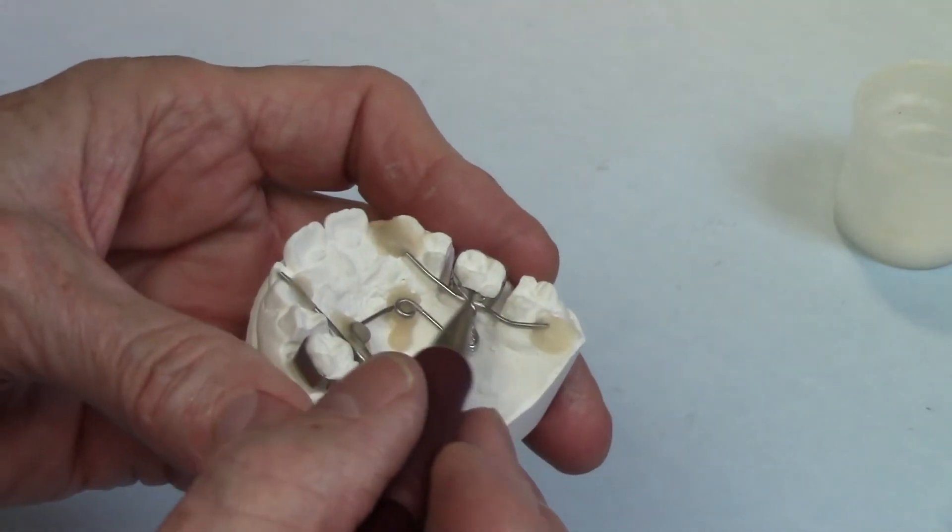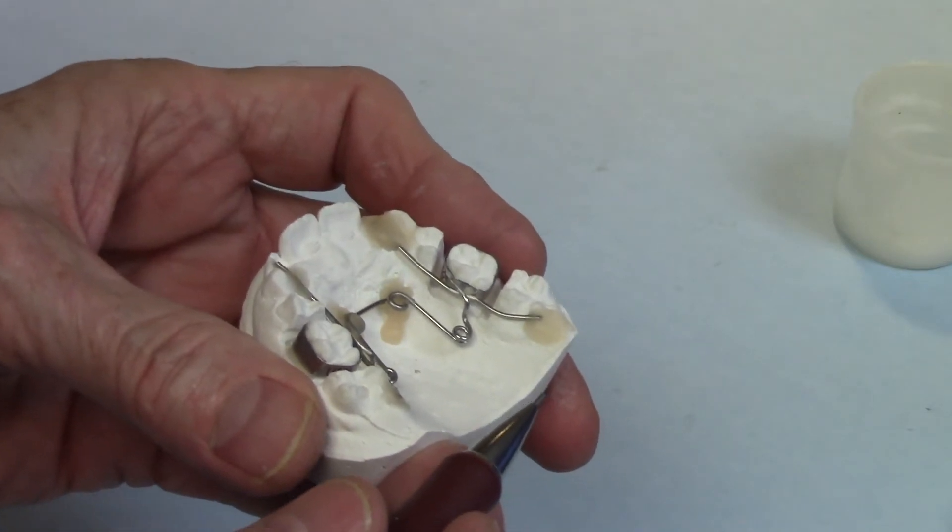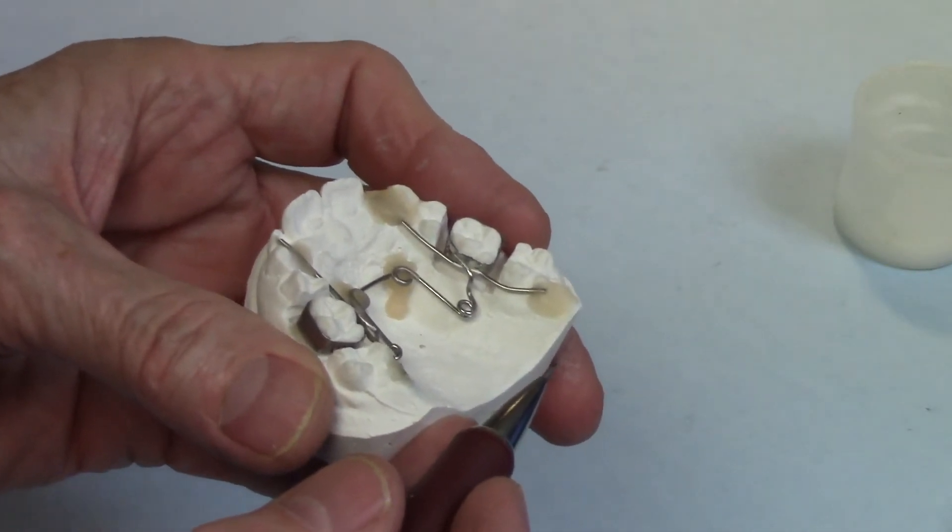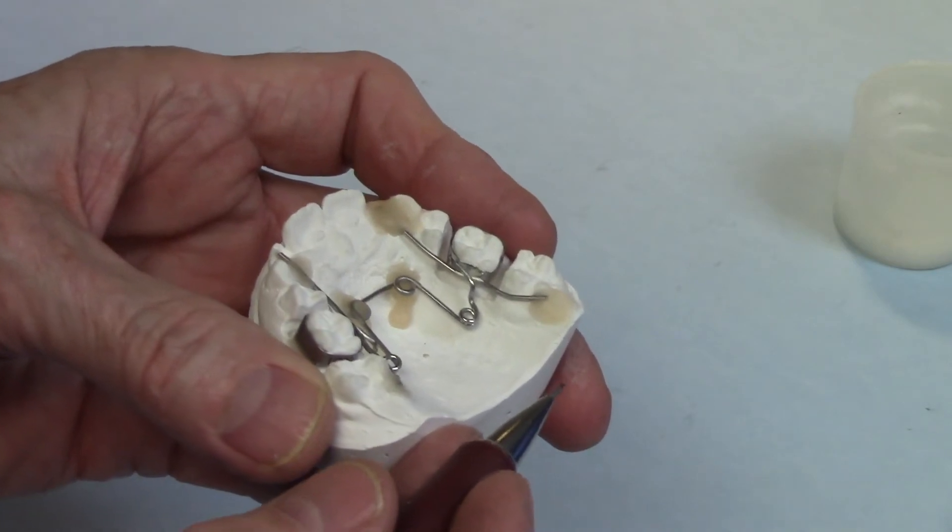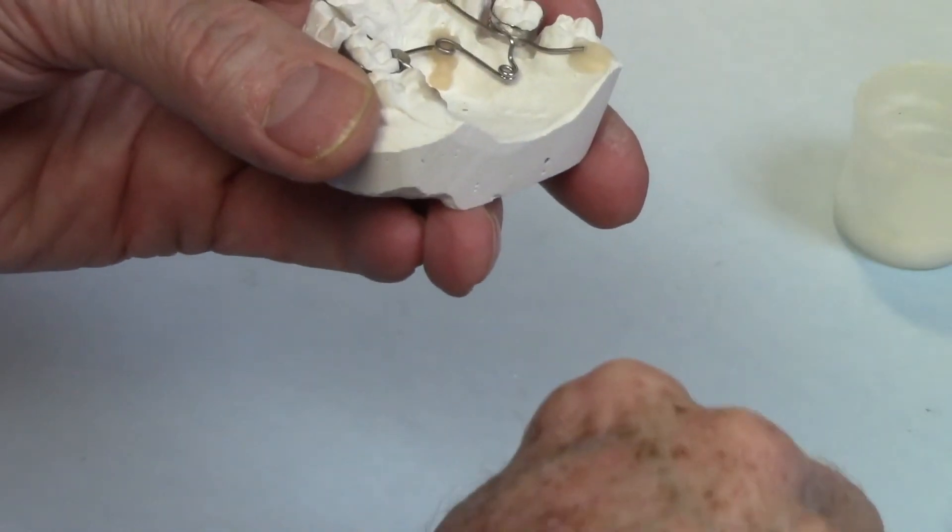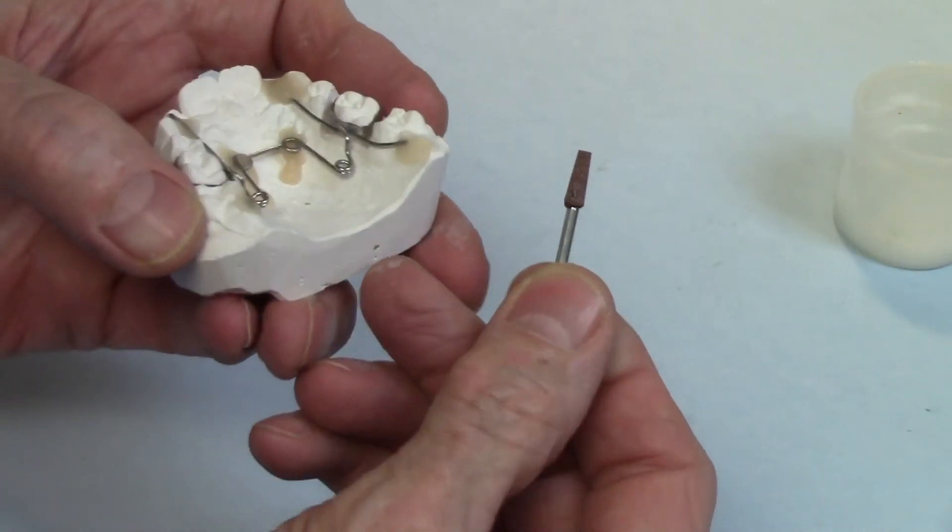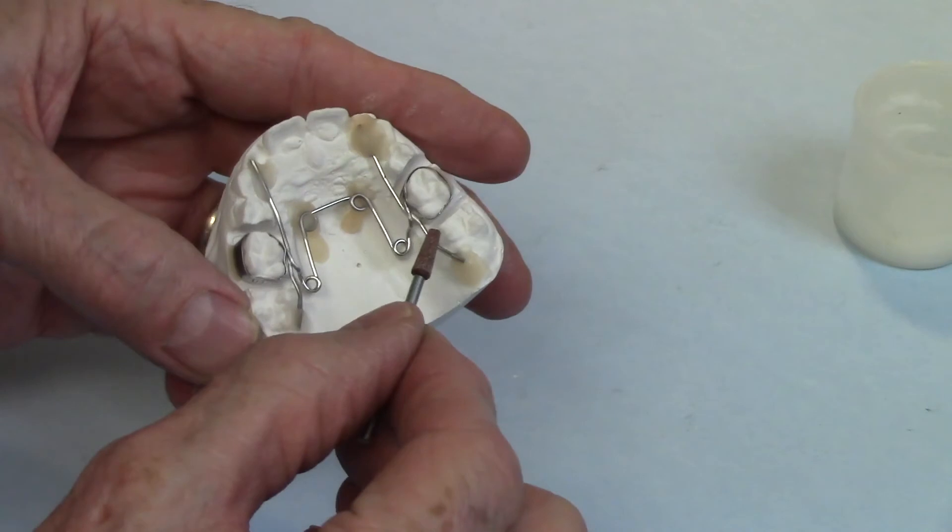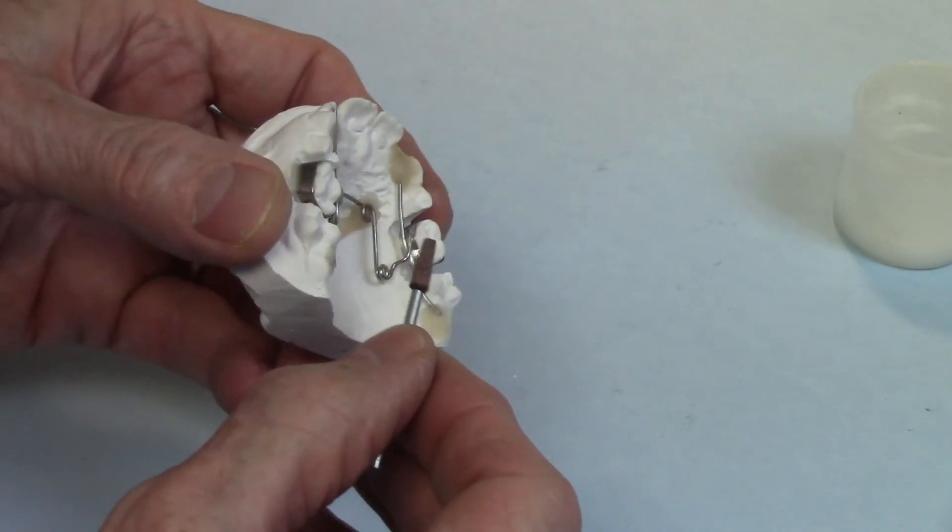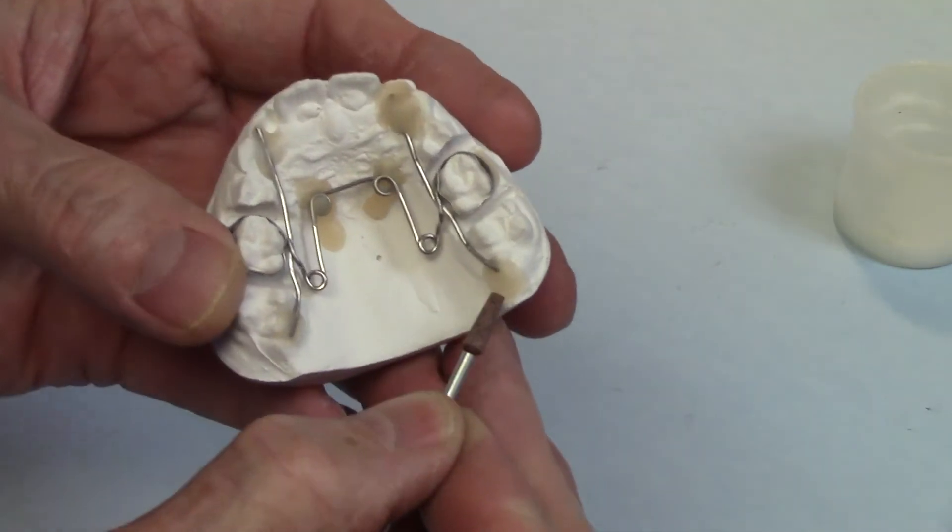It greatly reduces the mechanical adhesion. So if you roughen up these wires, what you're doing is you're removing that burnished surface and you're exposing the subsurface porosity making a really good surface for that mechanical adhesion we talked about in the first video. And the way I do that is I use like a little mounted stone like this on a handpiece and I'll just run it over the wires and in the bands and get them nice and roughened up.